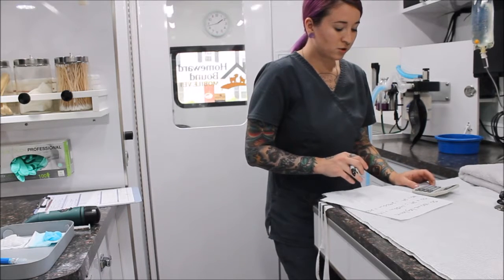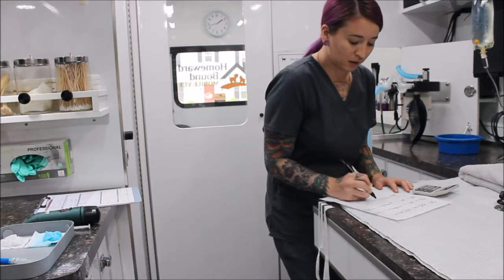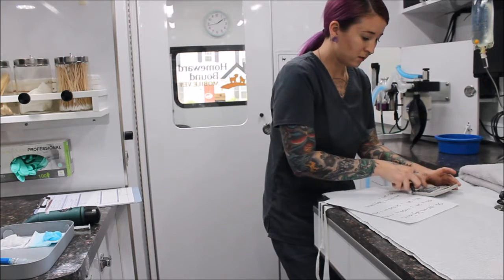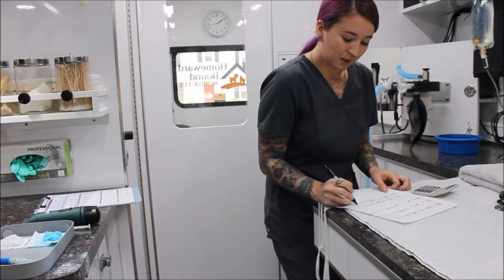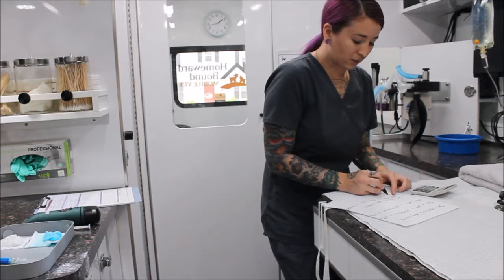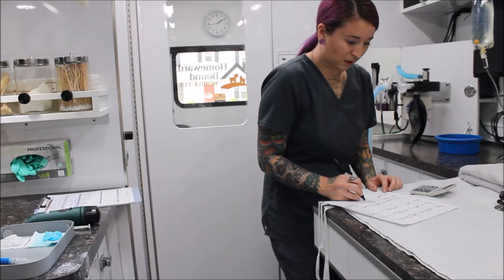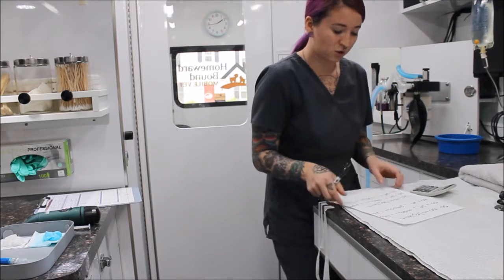So then we're going to calculate his maintenance dose, which is usually 20 to 40 milliliters per kilogram per minute. So again, we'll start with the lower end, do 20 times 29, which gives us 580 milliliters. So that would be 0.58 liters of oxygen. And then we'll do the same for the 40 ml. Let's see, 29 times 40 equals 1,160 mLs, which would be 1.1 liters of oxygen per minute.